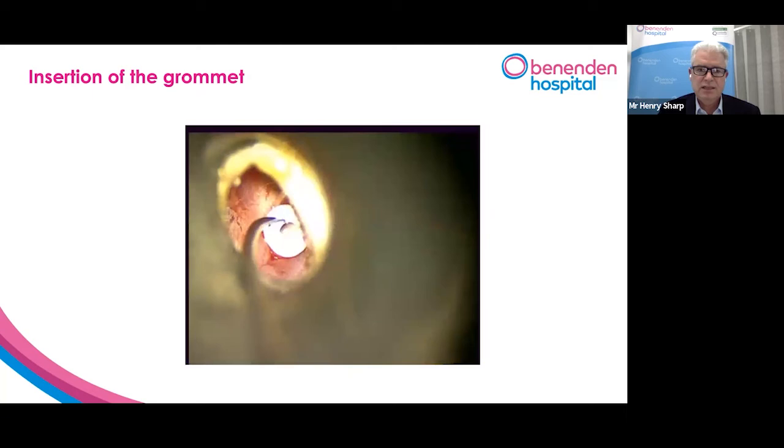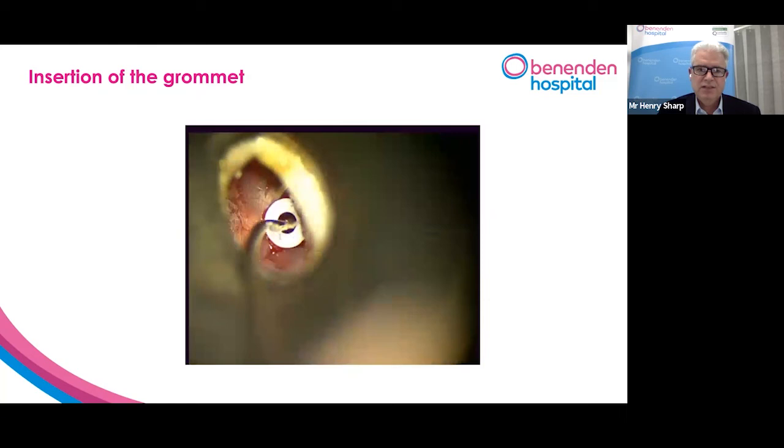So there's the grommet in position. You can see the hole down the middle, which allows the middle ear to ventilate and stops the fluid from reaccumulating inside the ear.